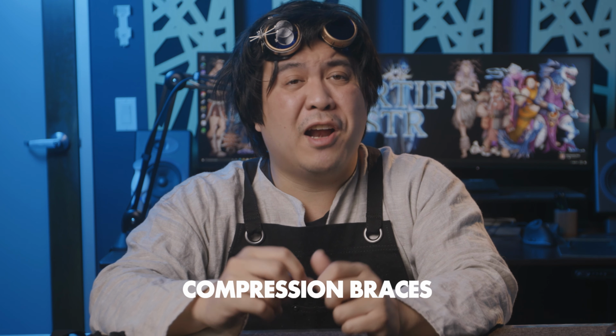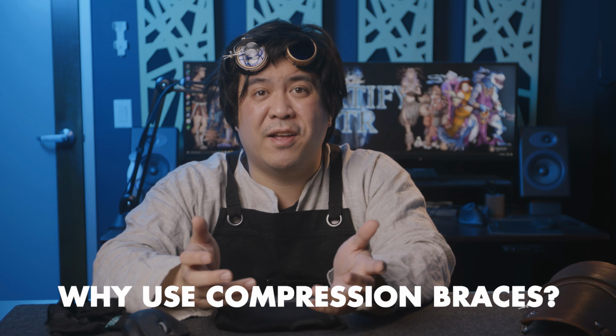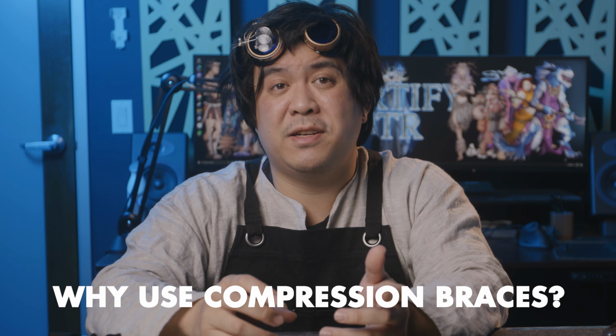As I said earlier, carpal tunnel syndrome is an issue that's caused by compression. So why do you want to add compression to the general area? Well, the short answer is because compression can reduce pain. When you wrap up a tight or painful muscle, it activates these deep pressure receptors that can relieve symptoms.